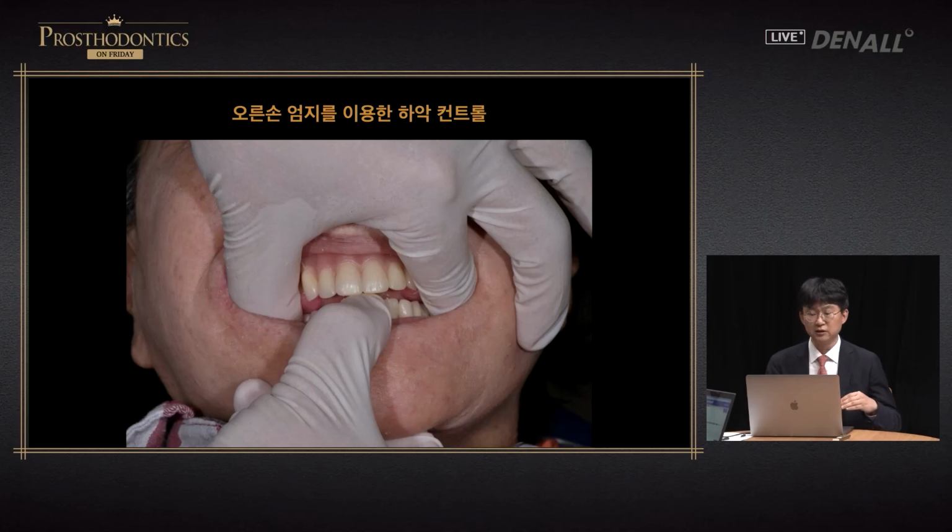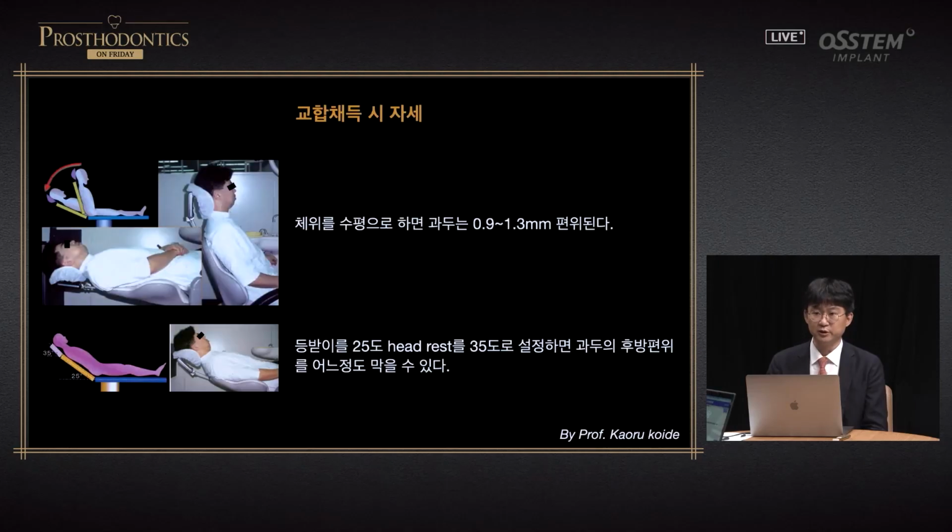When a patient cannot control the amount of mouth opening, we can use a right hand like this. The wax is put in, and the right hand works like a stop so that the posterior region would not be in contact. For a complete denture, it is not easy to use an anterior jig, so with the thumb in position, if the mouth is closed, the wax is used to take the bite when teeth are not in contact. And you can check with the mouth open.